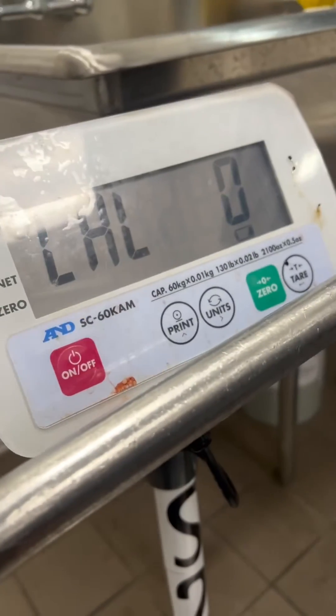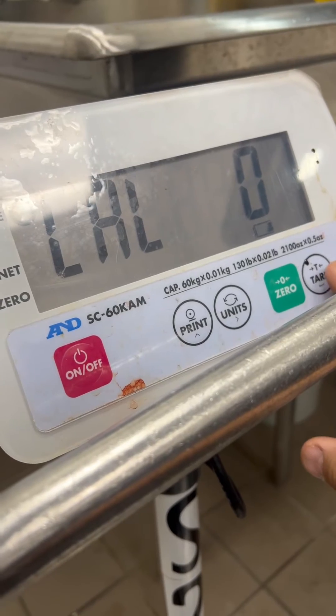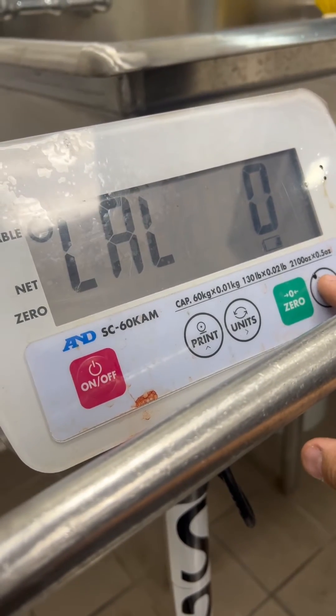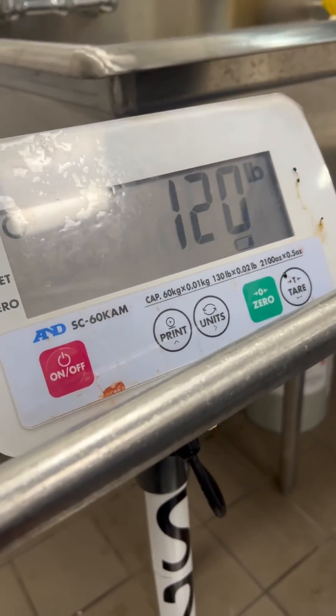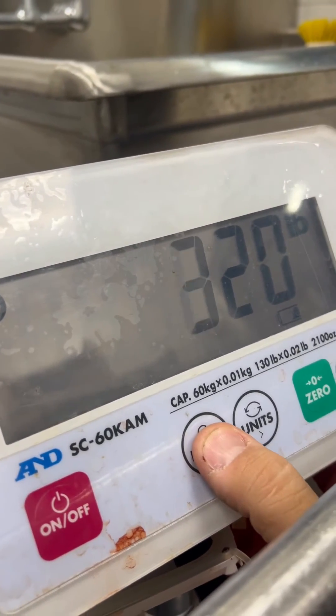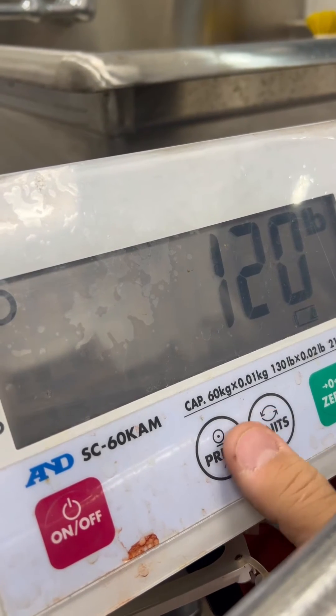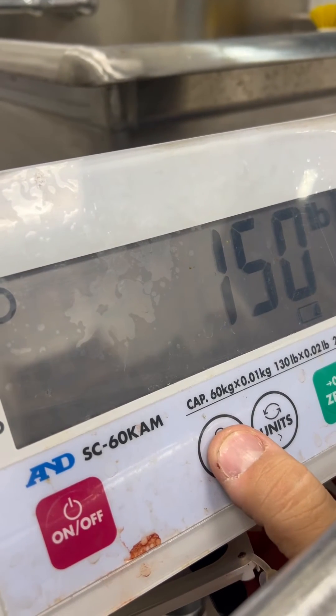As it's asking for zero weight, press your enter — which is the enter/tare key. That's set for 120 pounds, but obviously you can change that. I'm going to use 100.